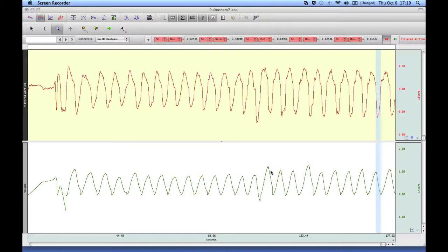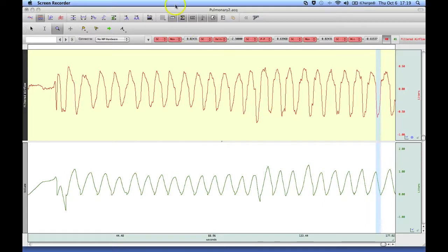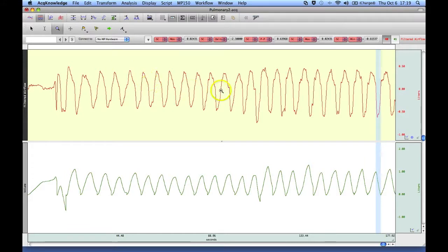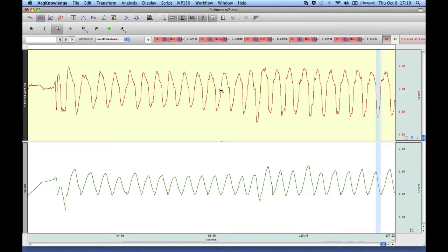The following screencast will demonstrate how to use Oconology's automated pulmonary airflow analysis routine. In this example, I'm showing a pulmonary airflow signal. This was taken from a human subject using a TSD-107 airflow transducer.